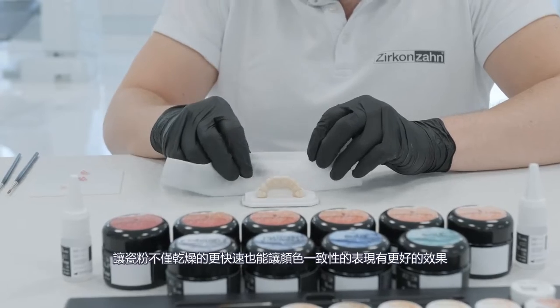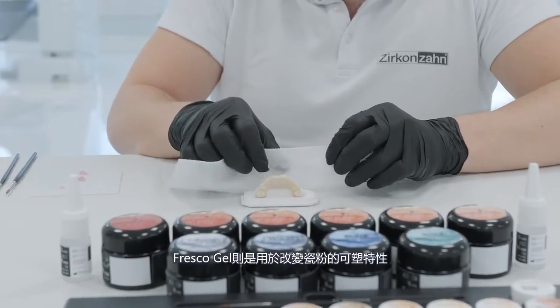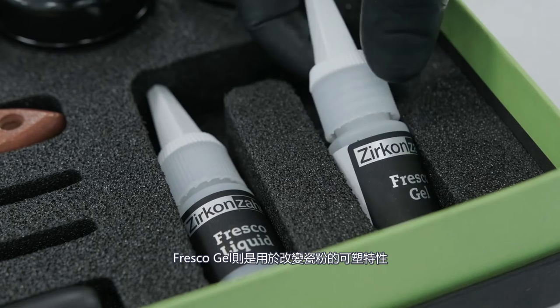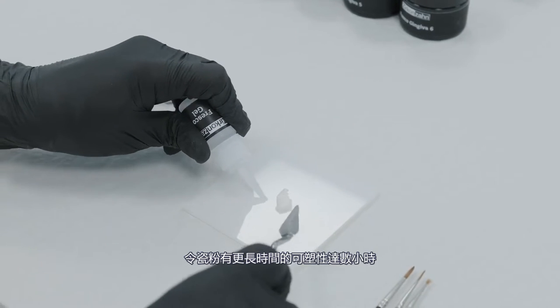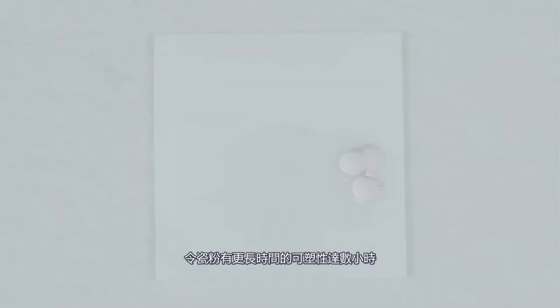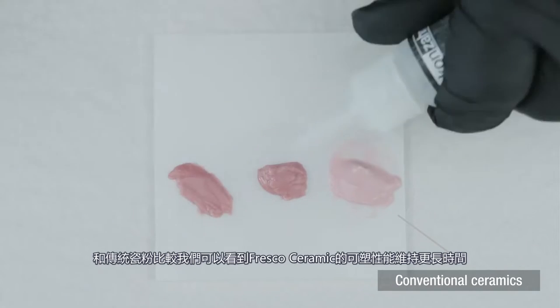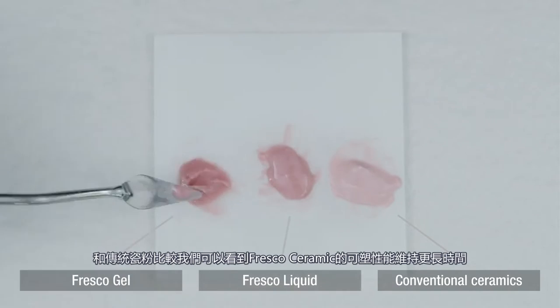When using Fresco Liquid, the paste not only dries faster and easier, but also reproduces the consistency of conventional ceramics. Fresco Gel is used to refresh the ceramic pastes and increase their modeling properties — they remain moist for a longer time and can be modeled for several hours. Compared to conventional ceramics, Fresco Ceramics can be modeled for a much longer time.